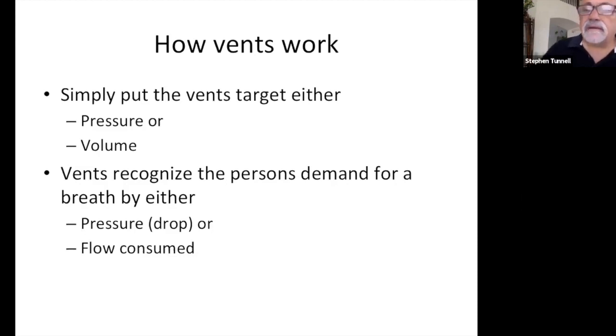So those patients that represent under 10% of the consumption of mechanical ventilation actually represent almost 80% of the resources allocated to caring for patients on mechanical ventilators. I'm not sure if that's clear, but a majority of patients, from a number standpoint, go on a ventilator and get off in 48 hours.